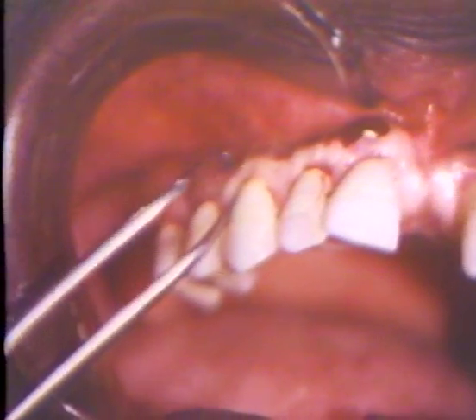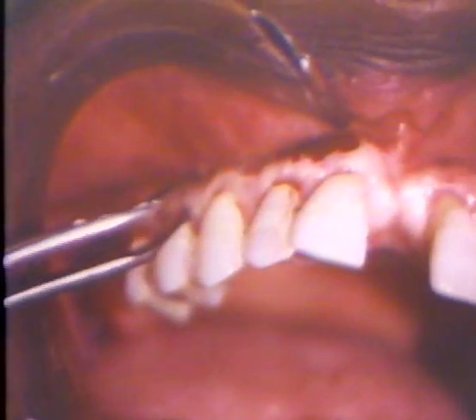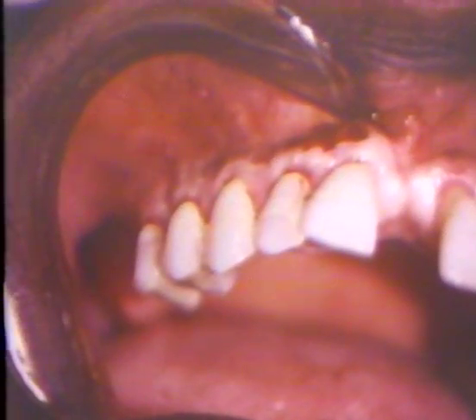The flat edge is placed into the pocket, the beaks are brought together and kept parallel to the long axis of the tooth. Noticing that the pocket depth approaches the mucogingival junction, we can understand why the gingivectomy procedure should not be used in this situation. There is depth in the buccal and the palatal aspect between the premolars.